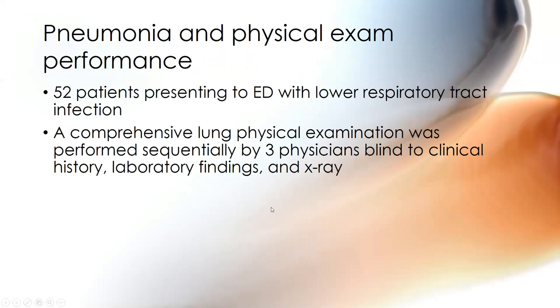I threw in some more miscellaneous stuff if you're not a believer in ultrasound yet. Because one thing is, you've got to get good at it. You just got to do it. You just got to keep practicing, otherwise you won't feel comfortable. And I'm going to say the majority of the time, maybe not majority, when you're scanning lung, it's very underwhelming because you can't see anything. Because normal aerated lung is just A-line pattern, lung slide, done. Move on, next, move on with your life.